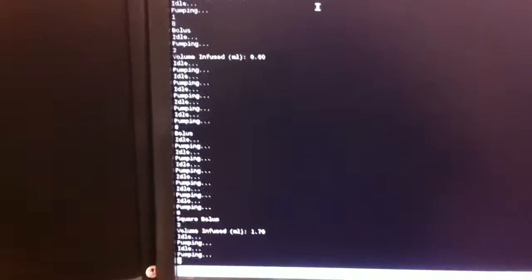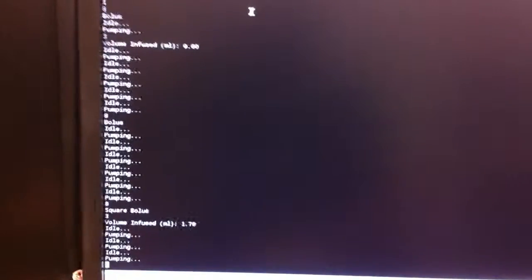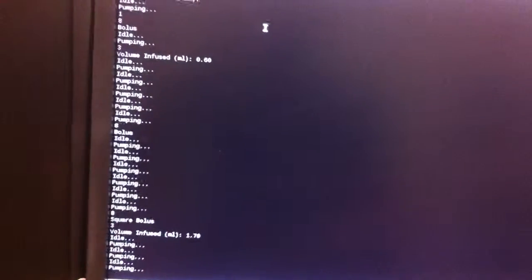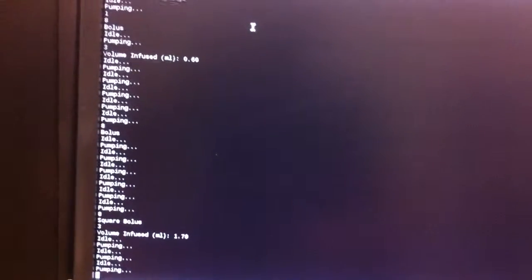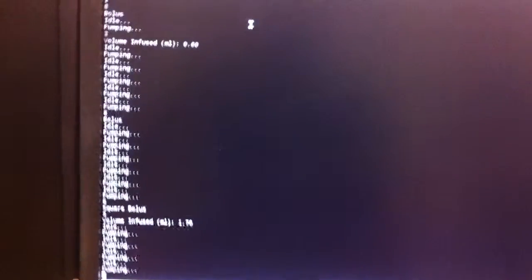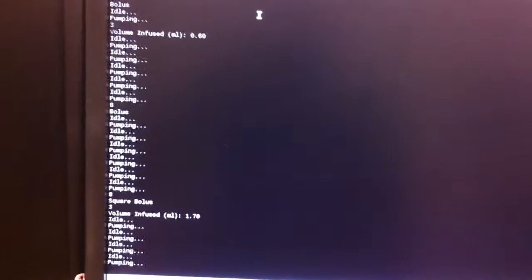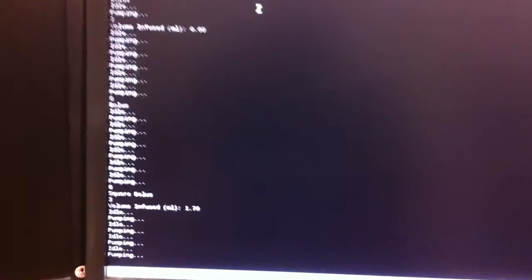And by the way, this is not a desired state, because everything should be specified in order to avoid this. I mean the basal flow rate, the maximum drug per hour, and the time between patient boluses, and also the clinician shouldn't issue too many doses.